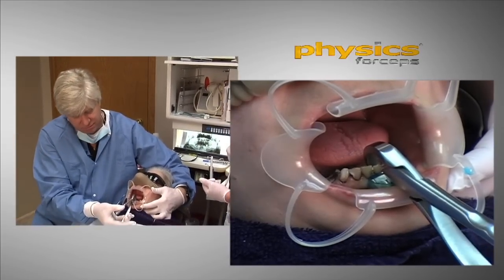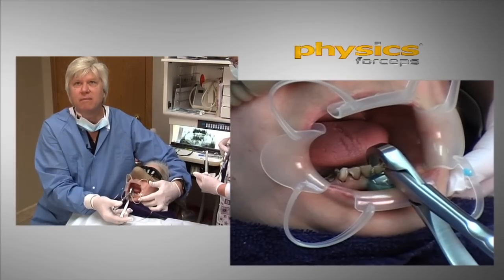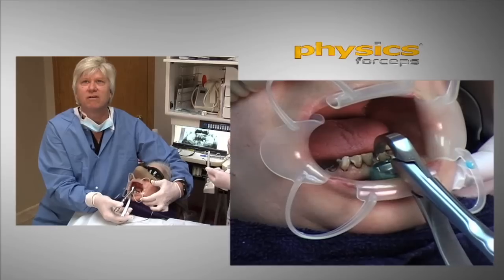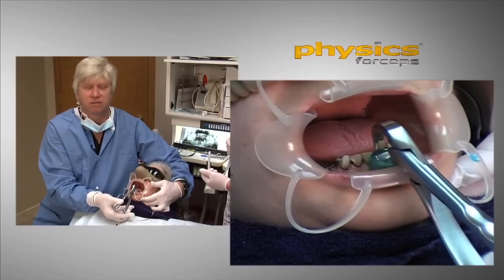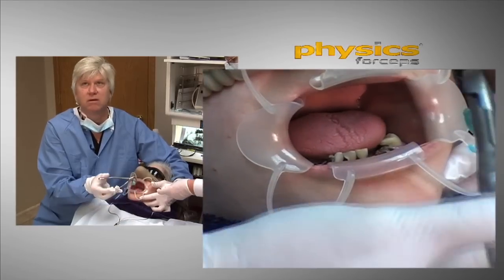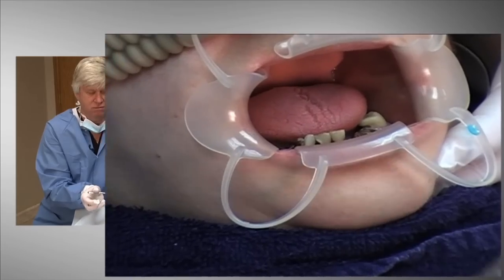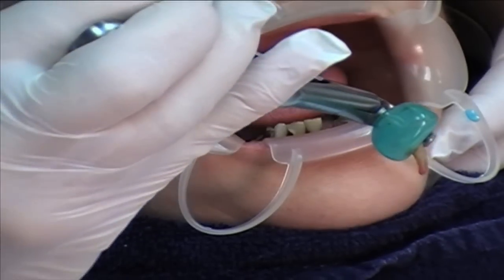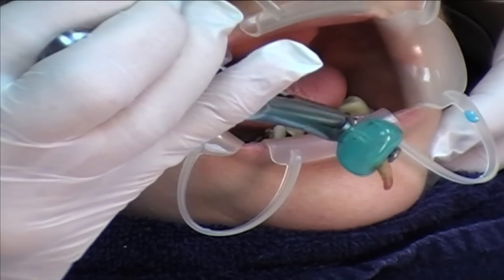It's coming. It's coming. Lift your chin up just a hair for me. Beautiful. And that tooth just elevated right out of the socket.